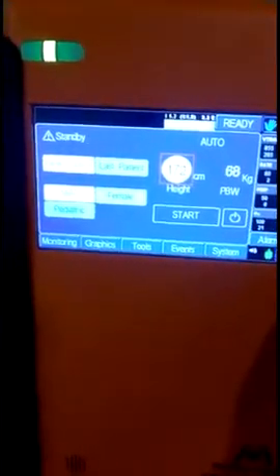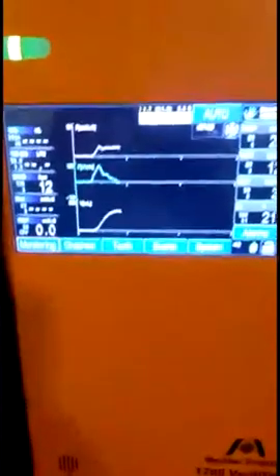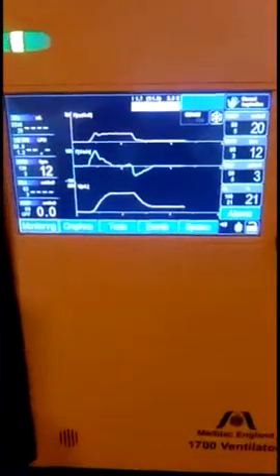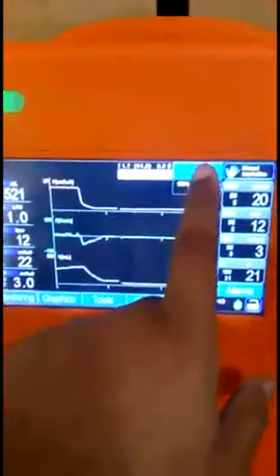For switching on the ventilator, there is an on/off switch on the right side. First you turn it on like this, then you will get a beep sound, and you have to press and hold the front button for 3 to 4 seconds until the display comes on the screen.